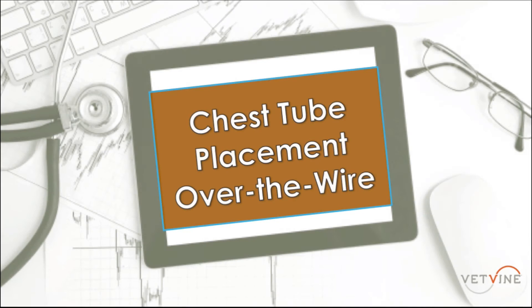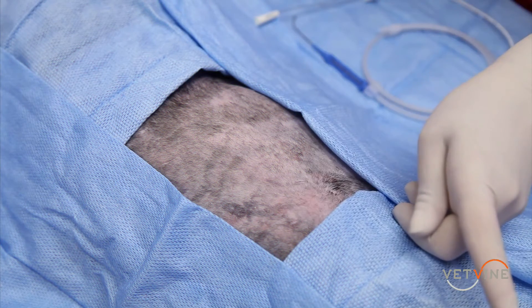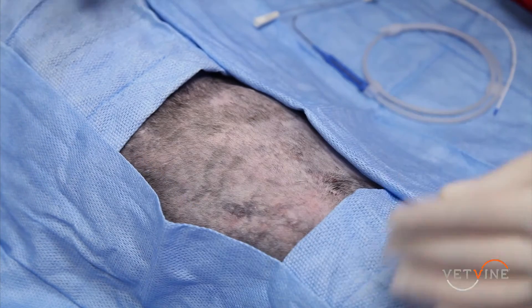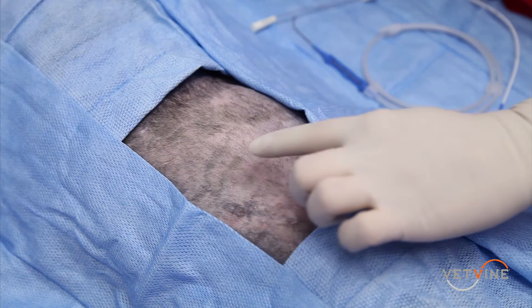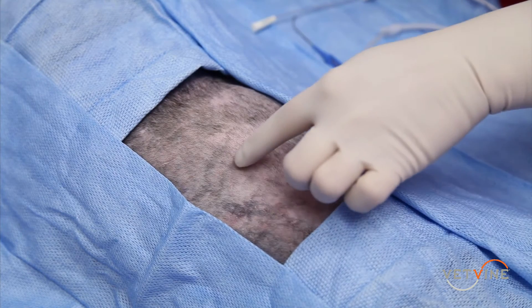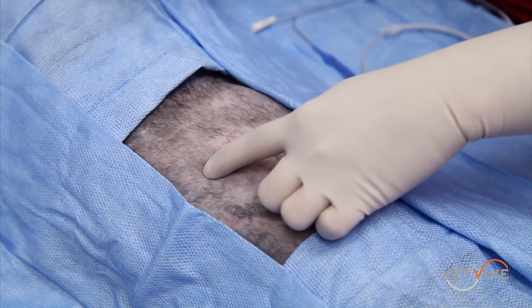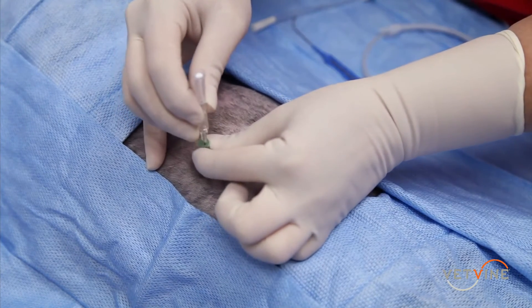Now we're going to place the Myla over-the-wire chest tube, or thoracic drainage catheter. The patient's head is going cranially and the tail is going caudally. We've clipped and aseptically scrubbed the lateral thorax from dorsal midline to ventral midline. Remember that this patient is sedated with just a local anesthetic block. Ideally, we want to place the catheter in the 7th to 9th intercostal space. The placement of this catheter does not require any tunneling.